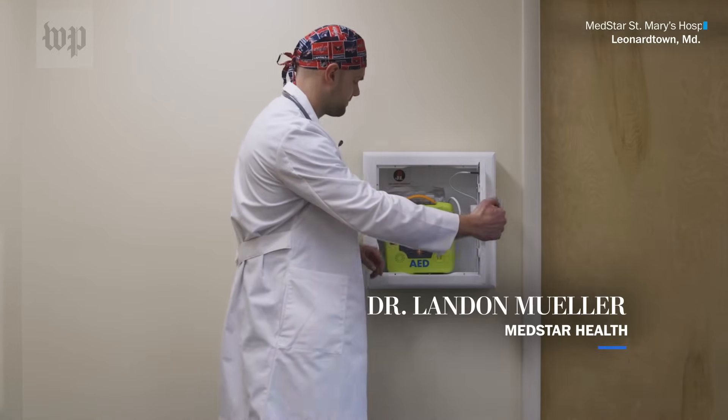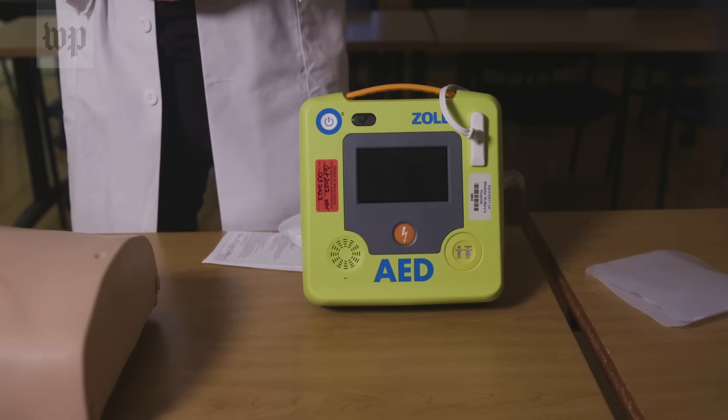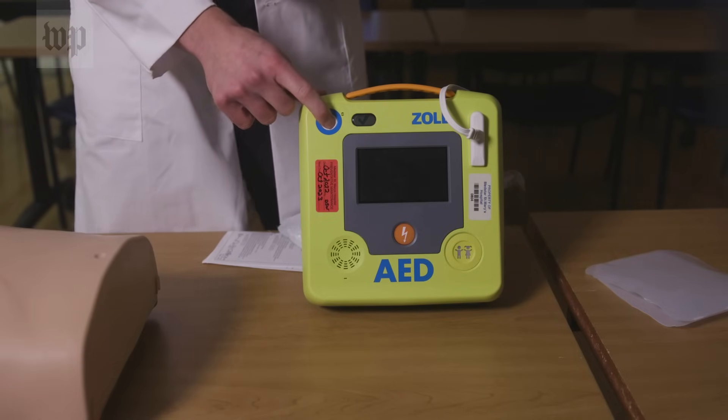To start grabbing an AED, you just pull open the door. Often times there will be a loud alarm associated with it. Turn the device on. It's going to talk to you in a loud voice and it's going to tell you what to do.